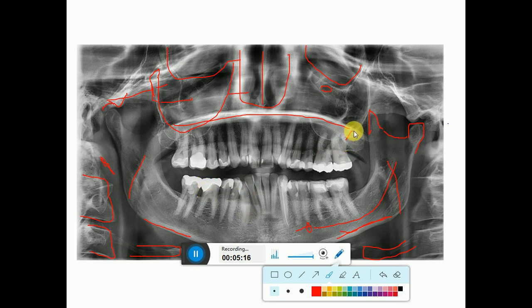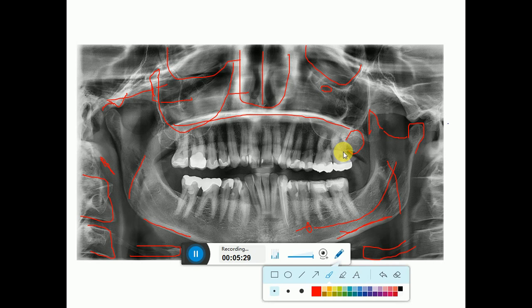One more thing — this is the tuberosity area of the maxilla. If the last tooth present in the maxilla is the second molar, the tuberosity will be present posterior to the second molar. If it is the third molar, it will be present posterior to the third molar.